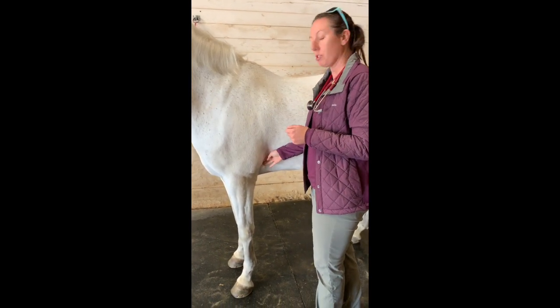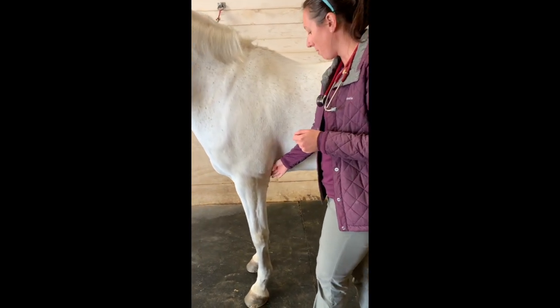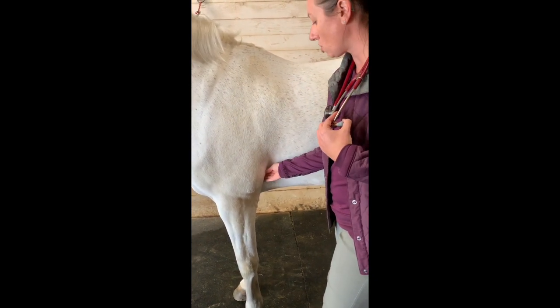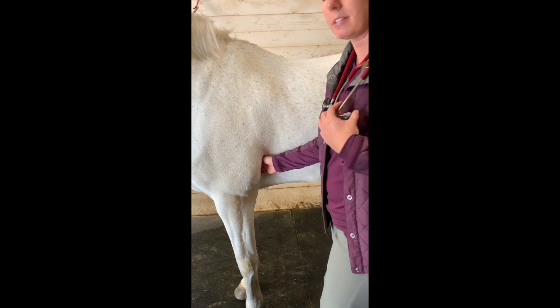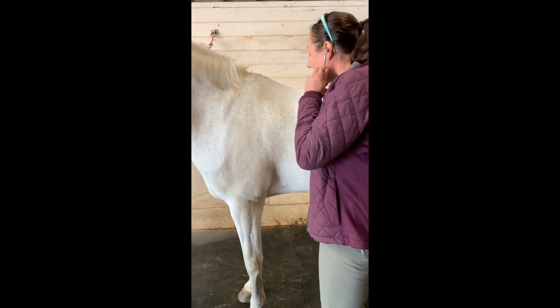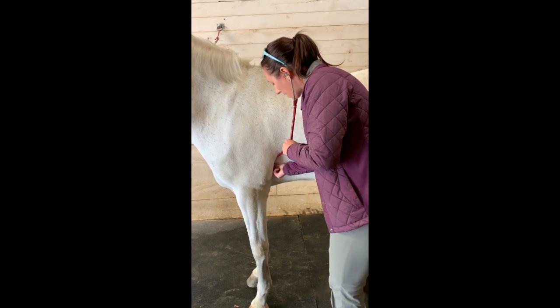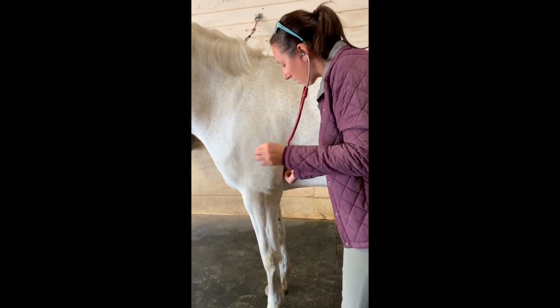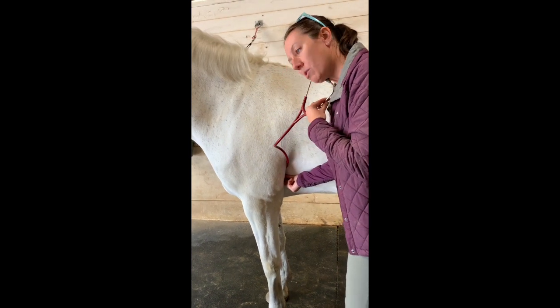The horse's heart is best listened to on the left side behind the elbow. You're going to take your stethoscope and shove it up kind of behind the tricep along the ribs, right here like this. You're going to hear lub-dub, lub-dub, and each of those counts as one.